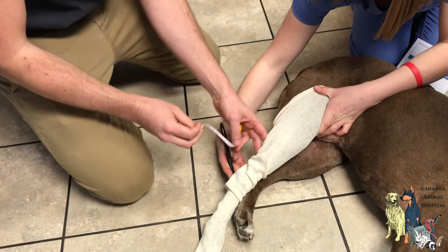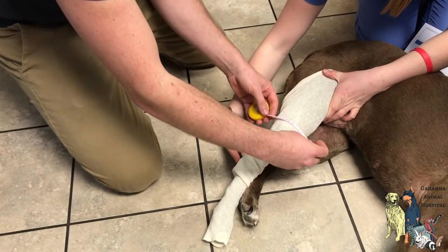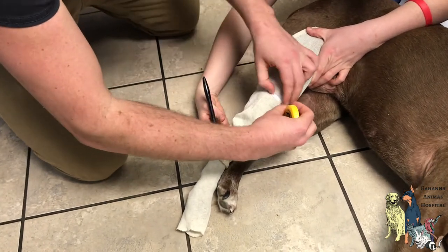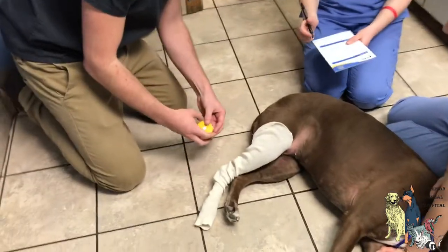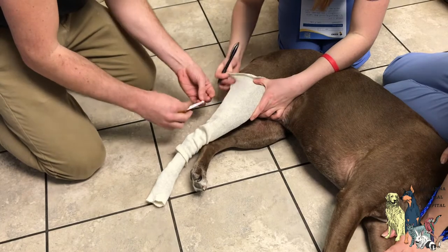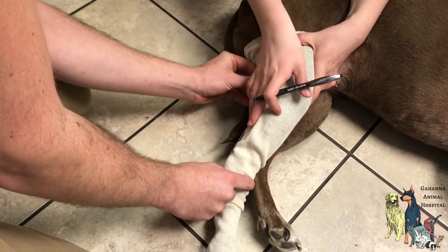The next measurement is below the popliteal space. This is where the popliteal lymph node is, so I know to go here, and that's eight inches. The last measurement is from that popliteal space to the calcaneus, which is the Achilles heel, and that is six inches.